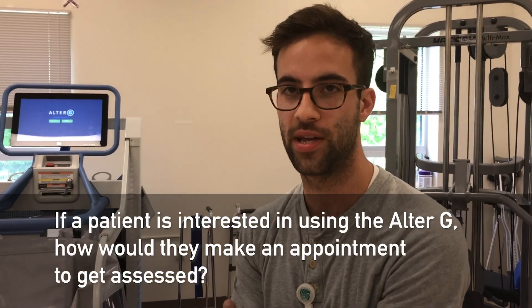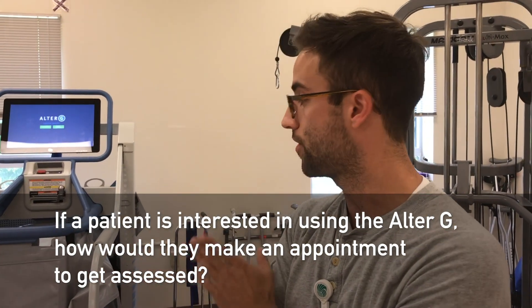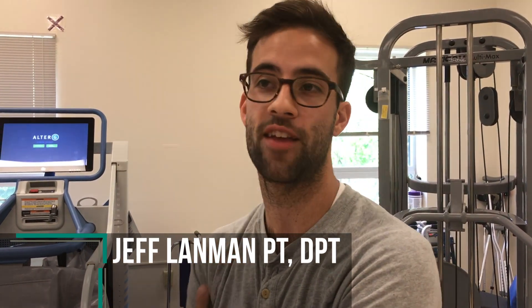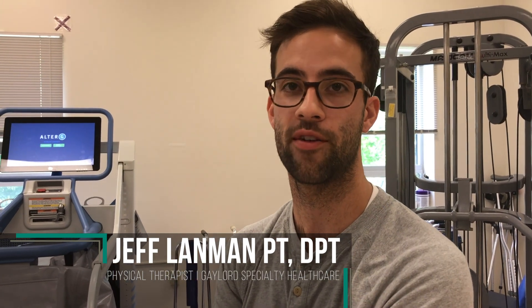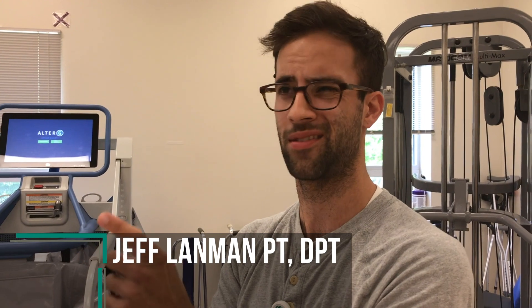If they have a regular evaluation with PT, our normal evaluation process would apply. If it turns out they need any type of gait training or improvement with balance, we can put them in there. We're also starting an option where patients can come in and pay for time by use — I think we're charging in 15-minute increments — so if anyone wanted to come and use it, they could.